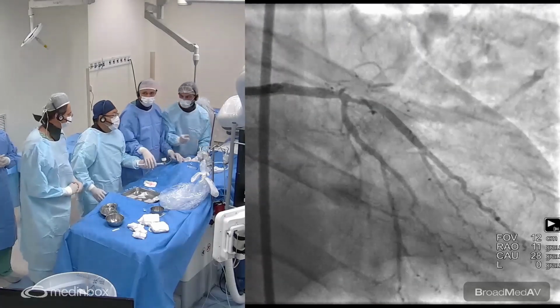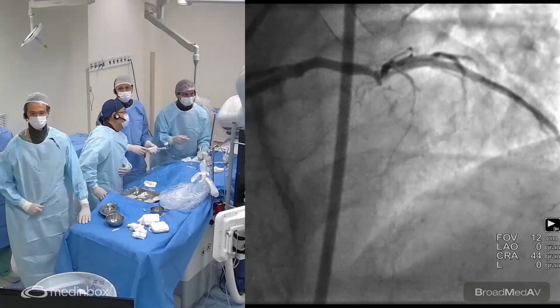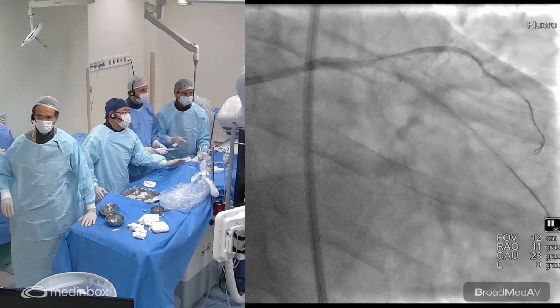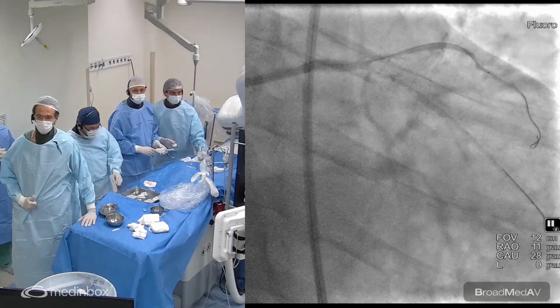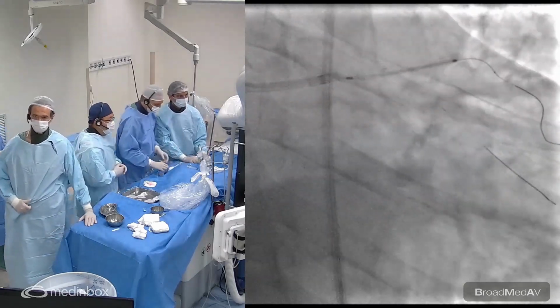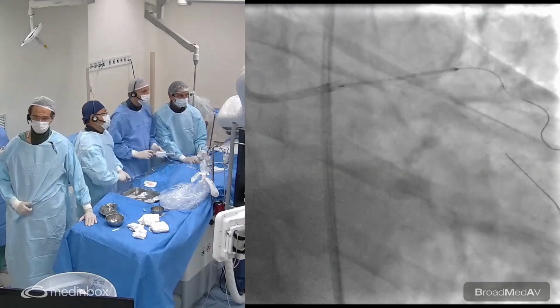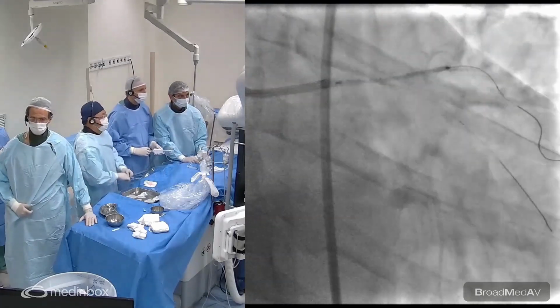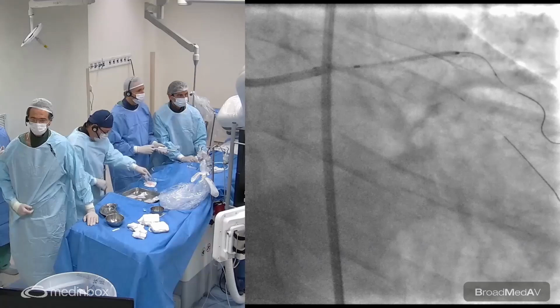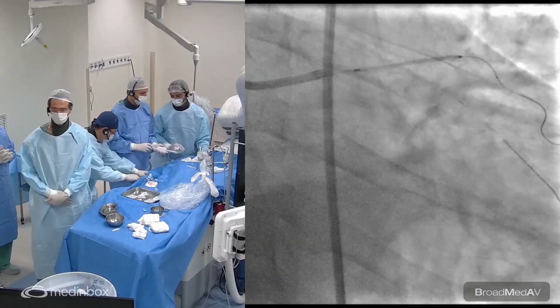And how it looks. In the left main, it's very important to leave at least 8 millimeters or more, depending on the size of the balloon you have, to do the proximal optimization technique. So now you're trying to look at the first angle. This is the reference, and now we are testing here. A little bit more forward. So, moving forward a little bit, okay. You see that's enough room to do the POT. I like this position here.